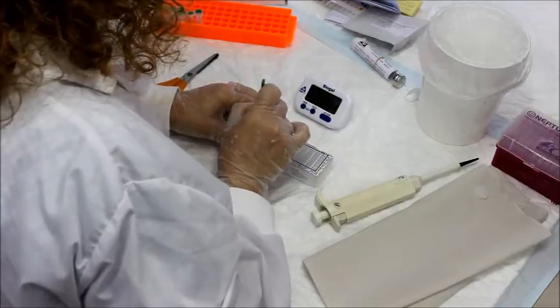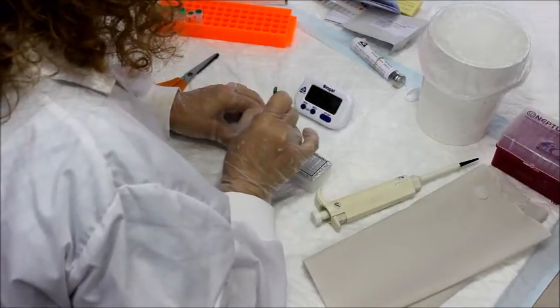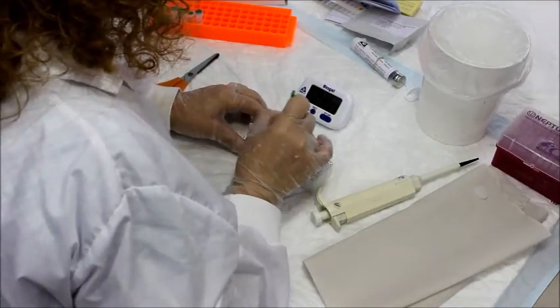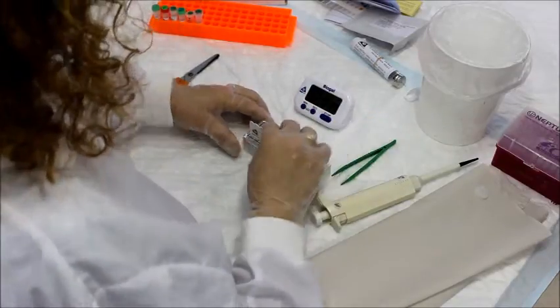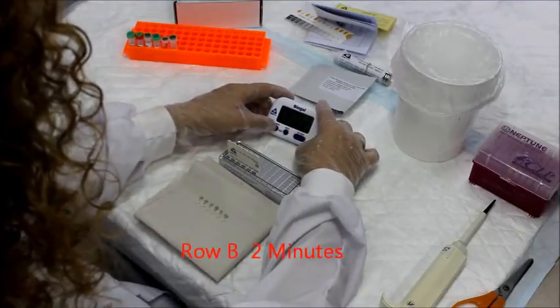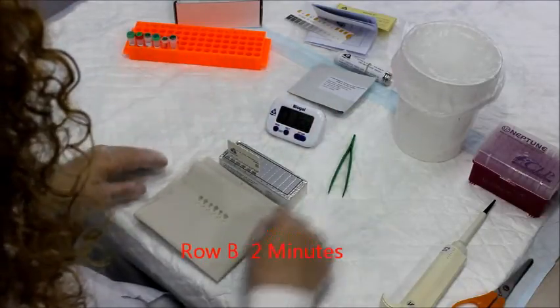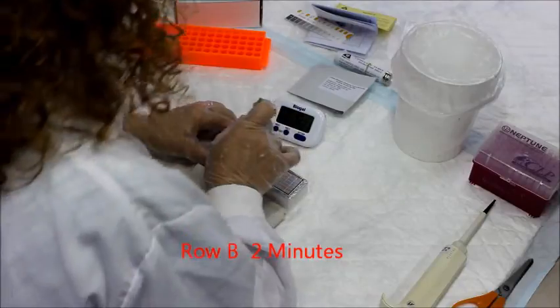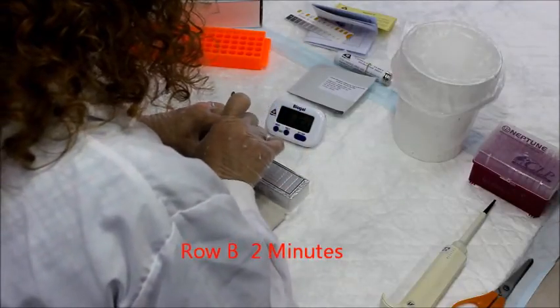Use tweezers to pierce the foil in the next row, which would be row B, and insert comb for two minutes. Gently shake off excess liquid from the comb teeth onto a piece of tissue. Insert the comb into the next well, row C, for five minutes.